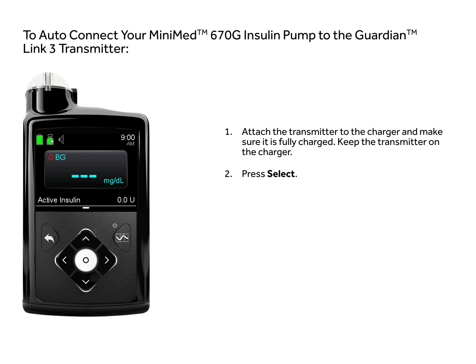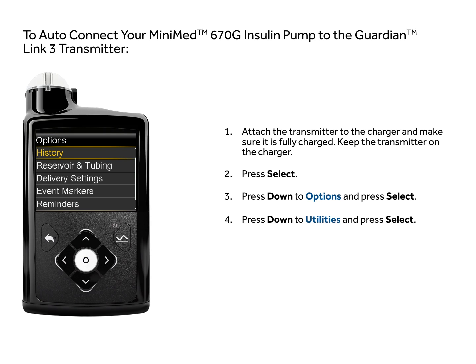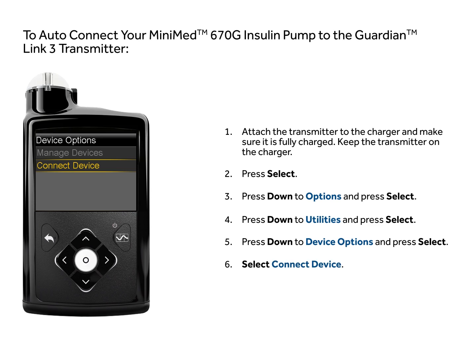Press Select. Press Down to Options and press Select. Press Down to Utilities and press Select. Press Down to Device Options and press Select. Select Connect Device. Press Down to Auto-Connect and press Select.